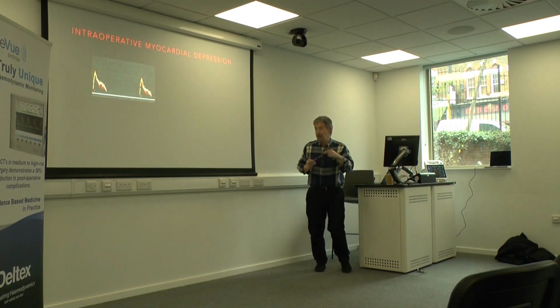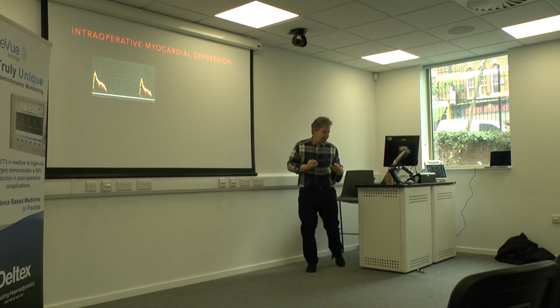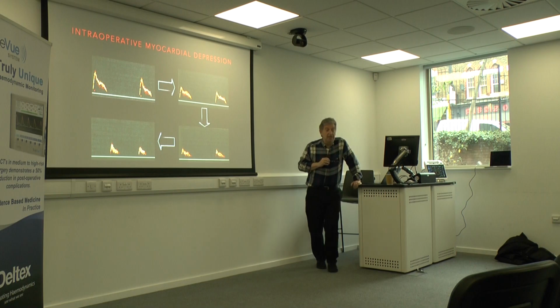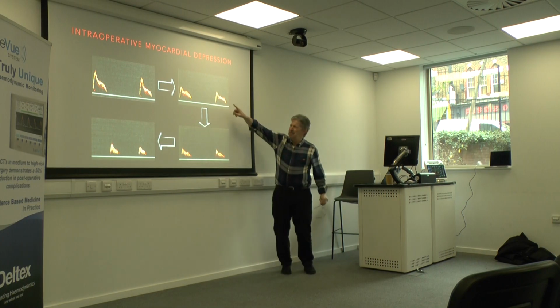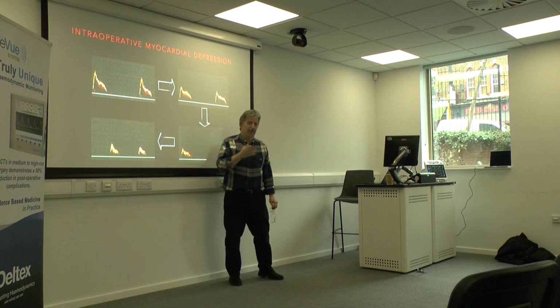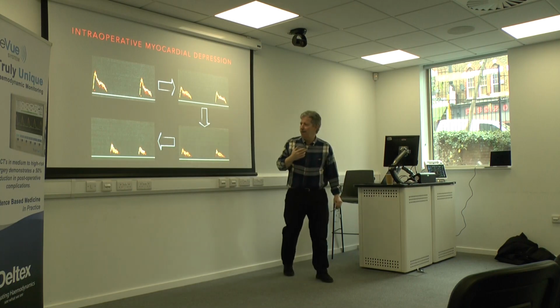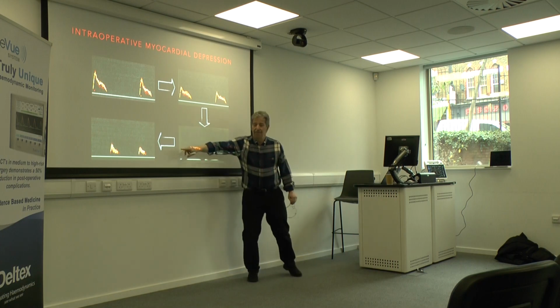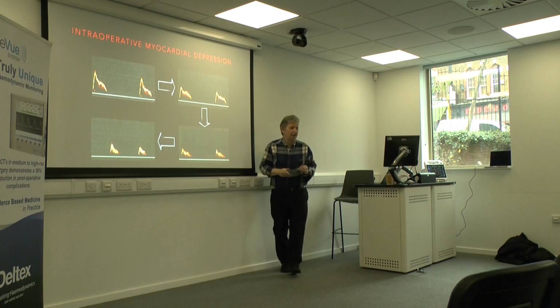This is a patient from the early days when I was going into cardiac theatre and we were just observing, we weren't interacting with the probe. But you can see this is a patient before they went on bypass. And the blood pressure was holding, but you can see things were looking worse. And at this point, the pressure did crash and the patient had to go on to emergency bypass. But you can see, just look at the deterioration much sooner. And so, again, we're going up that learning curve and getting the confidence that we could intervene before you get to that collapse stage.